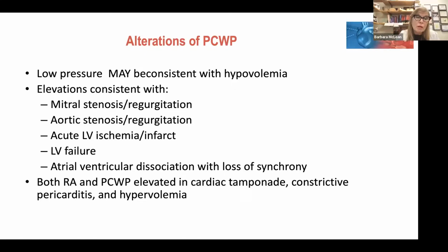The problem here is that when you're inserting the PA catheter, sometimes it's really hard to tell that you're in wedge because the A wave is really big or the V wave is really big, and you didn't really think that your catheter sailed into the wedge position. That's really important. Same kinds of things.